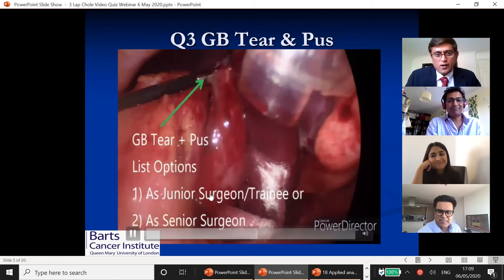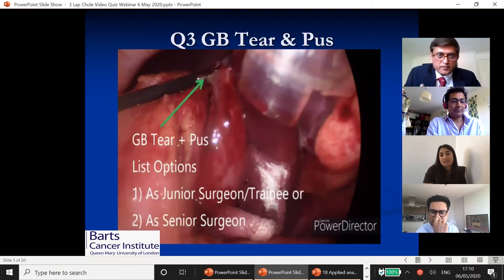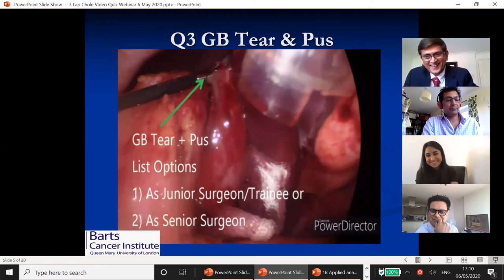So over here, Lillian, there's a question to you. At your stage, what would you do if this was going on live now? There's pus coming out of the gallbladder. There's pus coming out, and we've obviously perforated the gallbladder trying to hold and retract. It's slowly falling apart. Suction, call the boss, tell the anesthetist to give the patient antibiotics.